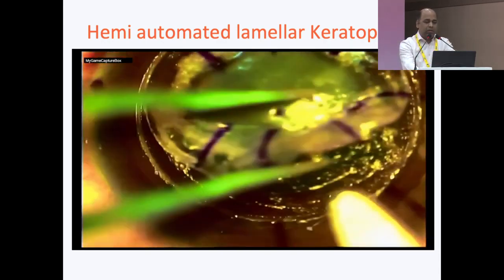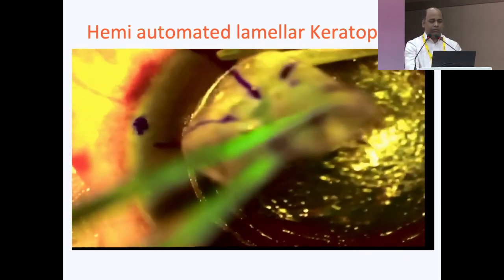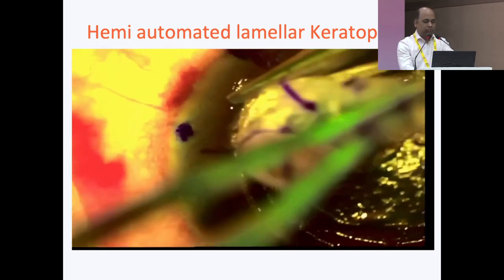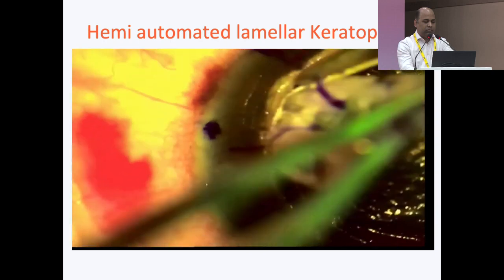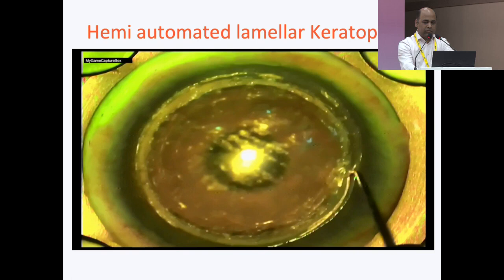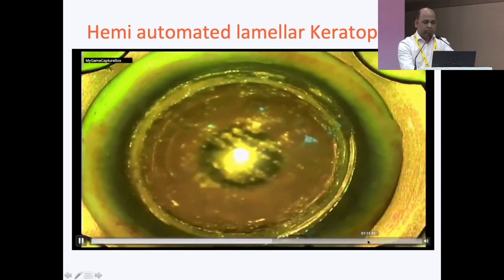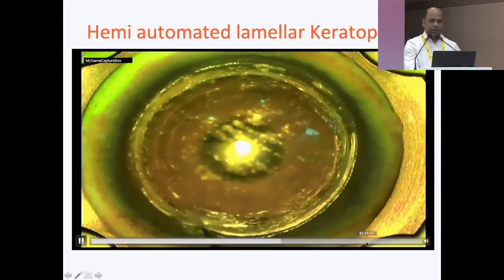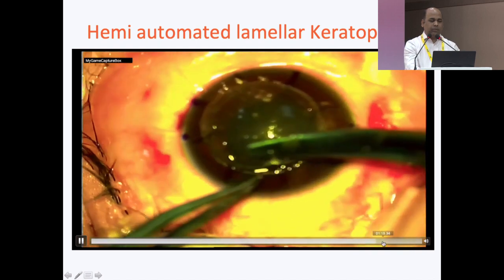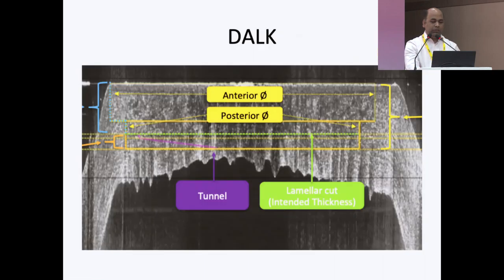So there is no chance of uneven surface post-operatively. And this is a donor dissection, and suturing is done. This case also did well in the post-operative period.